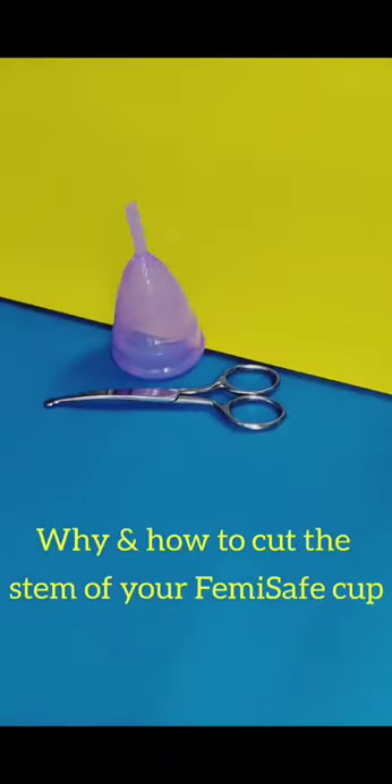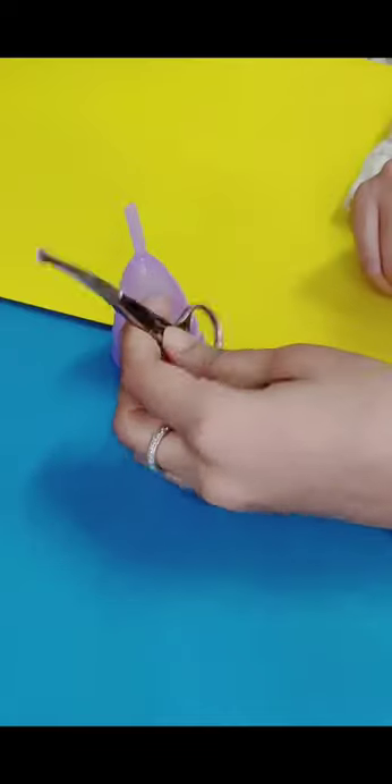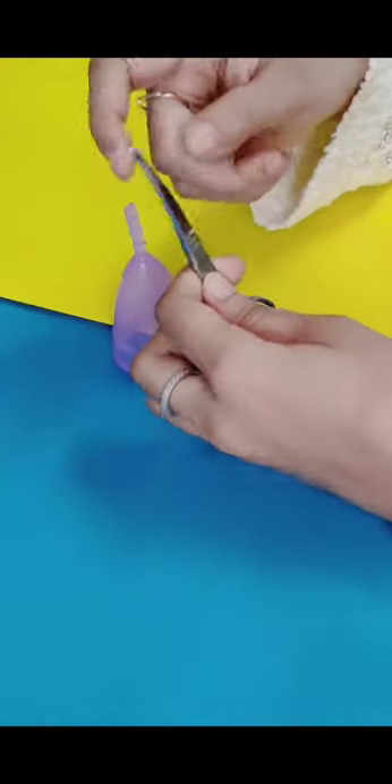Why and how to cut the stem of your menstrual cup — do this only if the stem is protruding. I will be using nail scissors, as they have a curved tip and are easy to cut with.